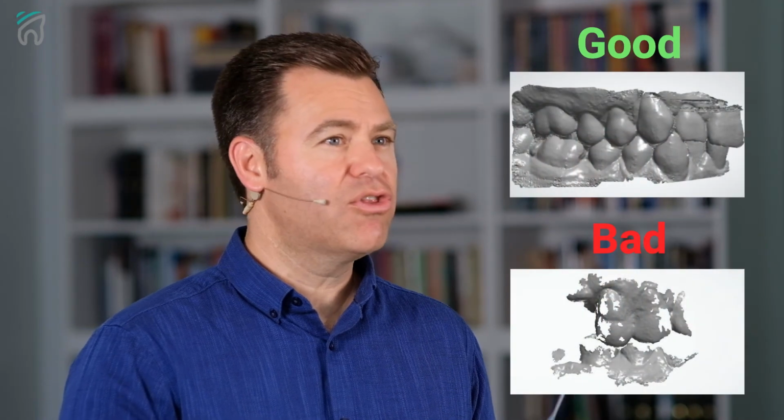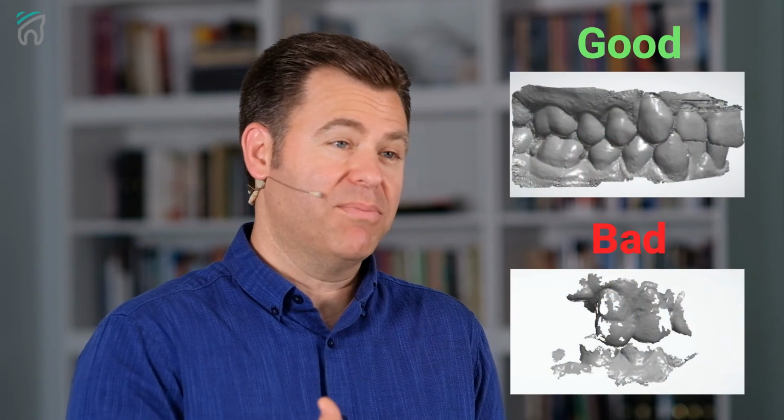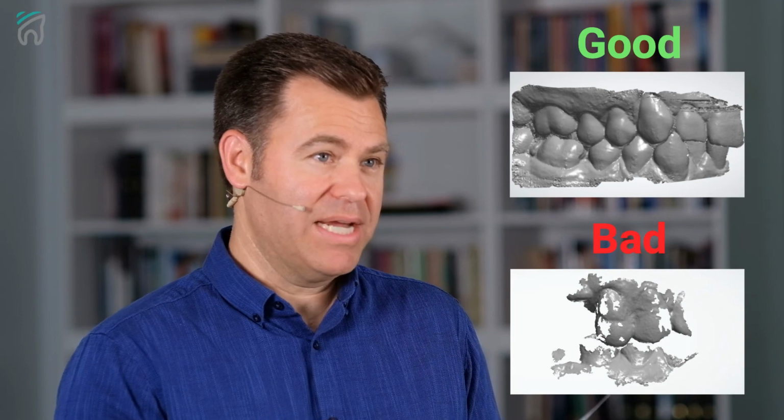Just get us a good thorough bite scan, because sometimes what will happen is that the software won't line up the bite correctly and we need to manually adjust it. And if we just have very limited data on the bite scan, it makes it very difficult to do that.